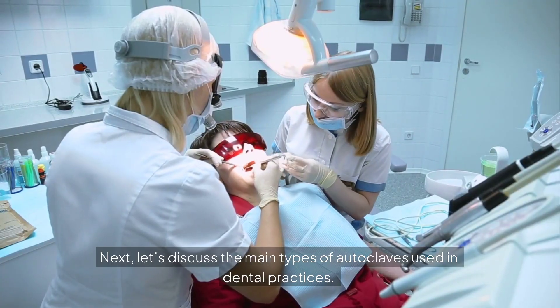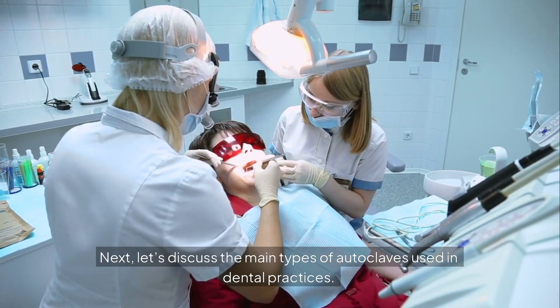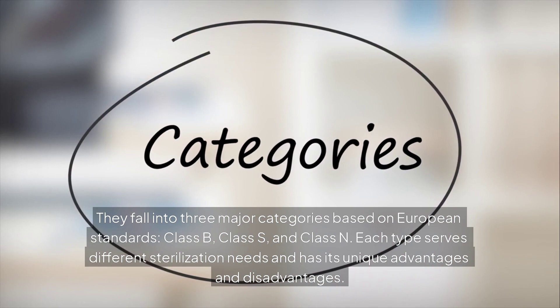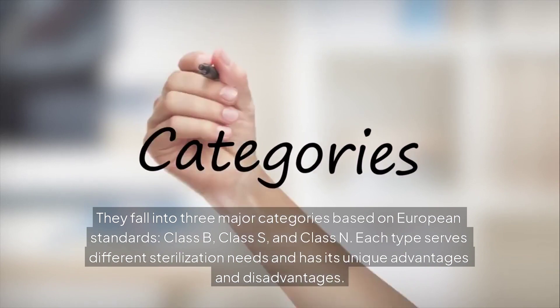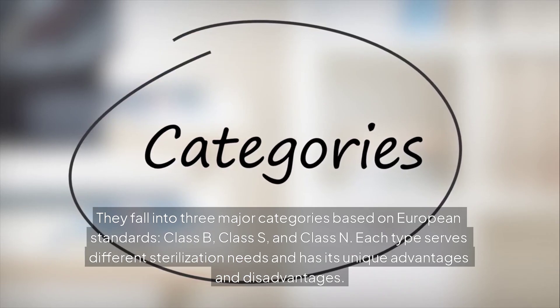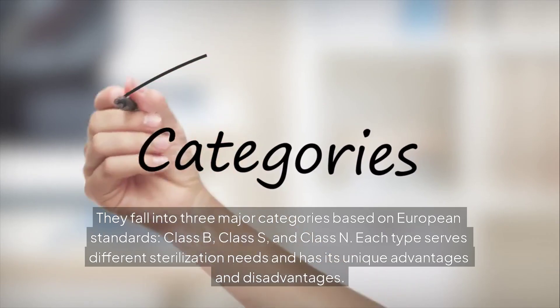Let's discuss the main types of autoclaves used in dental practices. They fall into three major categories based on European standards: Class B, Class S, and Class N. Each type serves different sterilization needs and has its unique advantages and disadvantages.